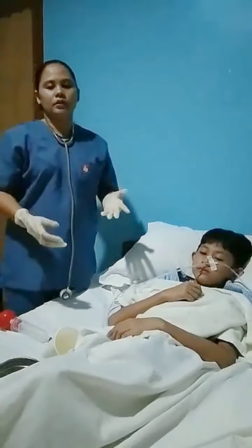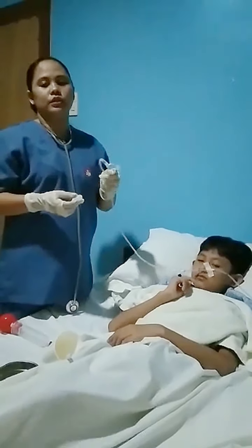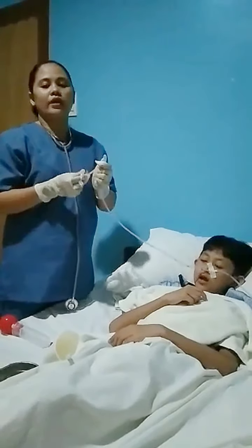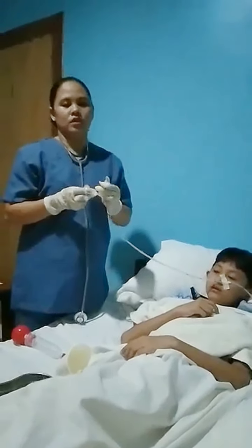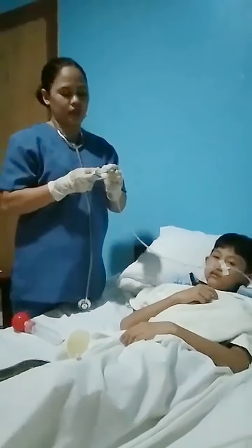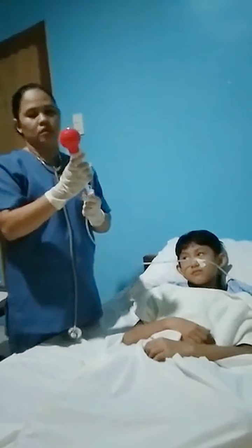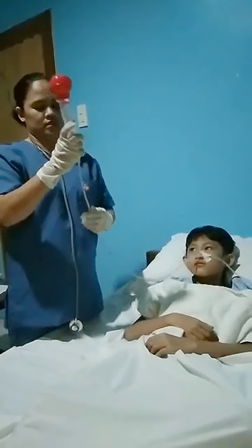Now, before we open the end of the lumen, we need to make sure that there is a kink. That way, we are preventing the air from going in and causing distension. So, insert now the aseptic syringe. And let go of the kink. Alright?